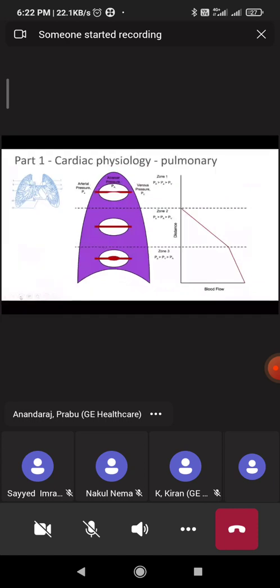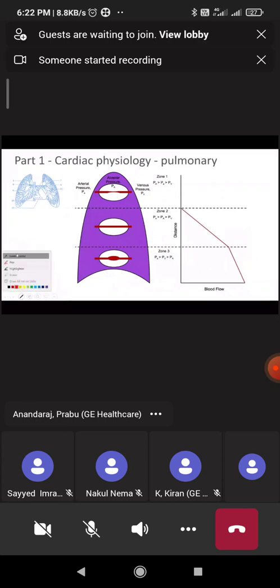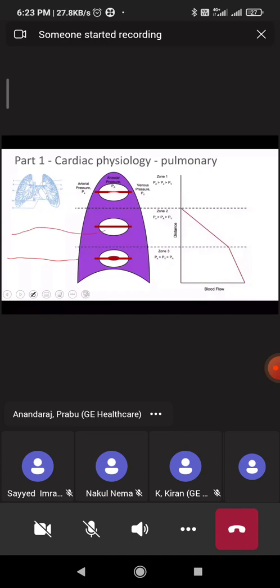So what happens in ARDS, a lot of fluid will be accumulating in the lung, everything will be depositing and it will keep on increasing, adding to this part, and more and more is added. So what the clinicians would like to do is they will rotate the patient. Like let's say the patient.